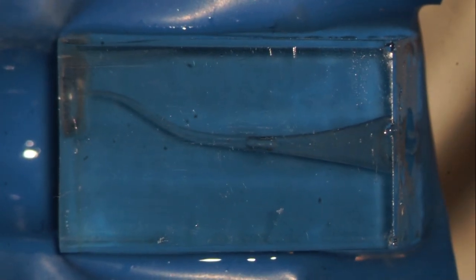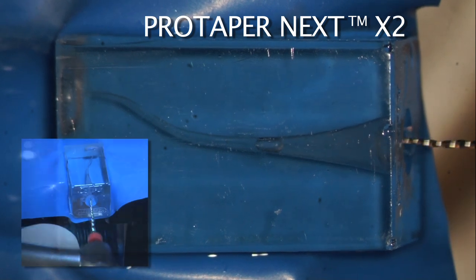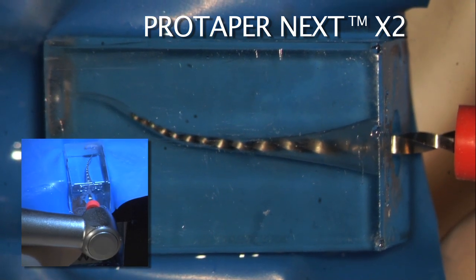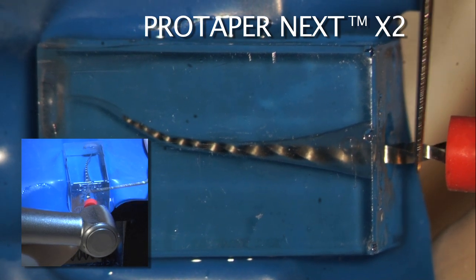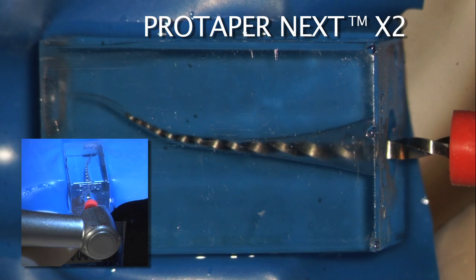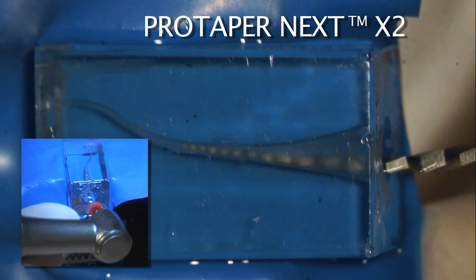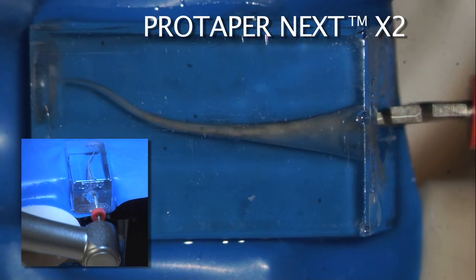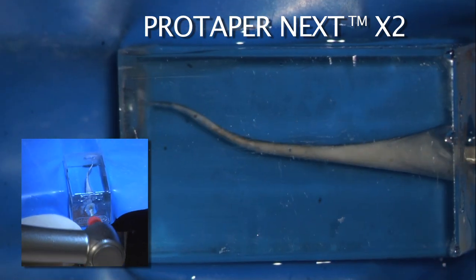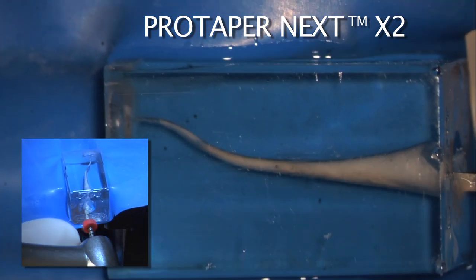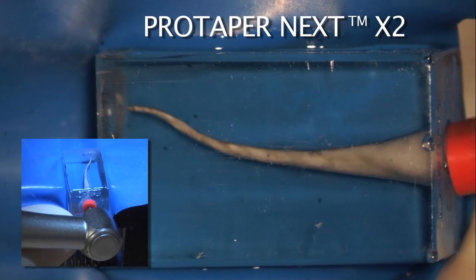We've taken our X1 file to length, we're ready to go to the X2. The X2 file is a 2506, remember it's progressive tapered. I like to put the file in and kind of judge how much work I have to do. If you want to know how much work you have to do, you only have to look at the distance between the bottom of the stop and your reference point to know there's just a little job of about two stops. It's always an even progression from instrument to instrument. So, importantly, before resistance, begin to paint, and as you brush, again you're making lateral space. And as you make lateral space, that will allow the instrument to float in passively a little bit deeper. You'll not notice any grabbing in this technique because the lateral space deactivates the instrument and minimizes its contact. Once we've brushed and made lateral space, we can float in just a little bit deeper, and a little bit deeper, and there we are at length.